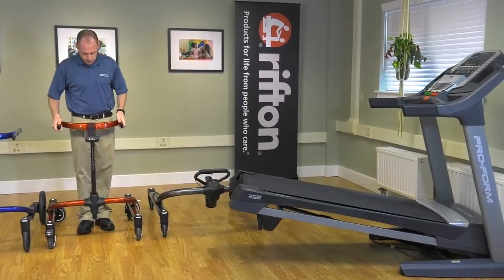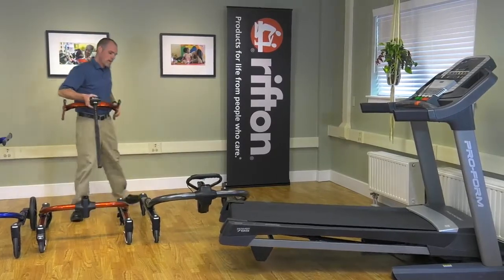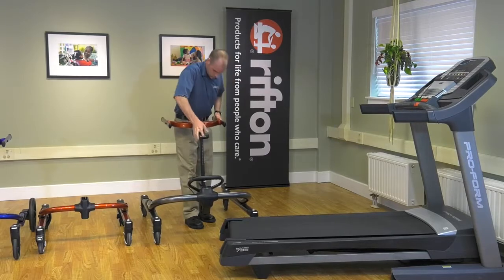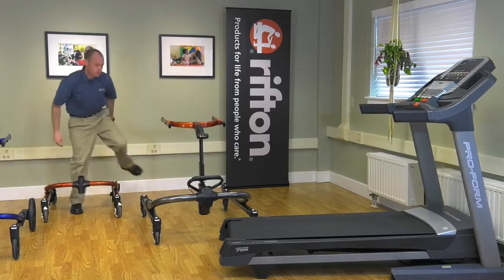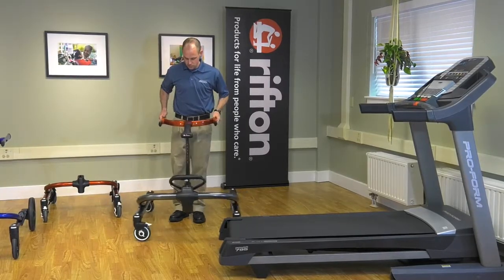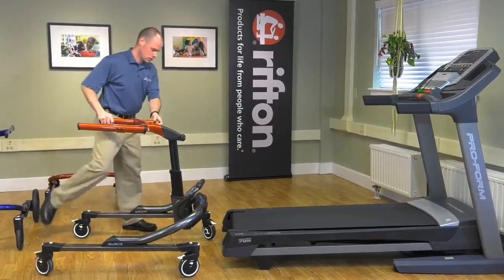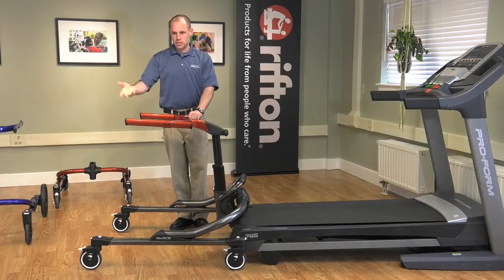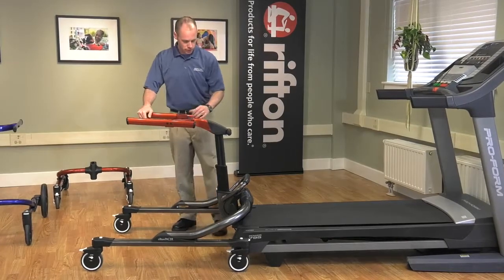So to use the treadmill base, you just take your base, and it inserts very nicely into the treadmill base. It clicks in, and then you bring your client from wherever they started out around to the front of the treadmill. When you get to the treadmill, then you'll want another therapist supporting the client to get up onto the treadmill.